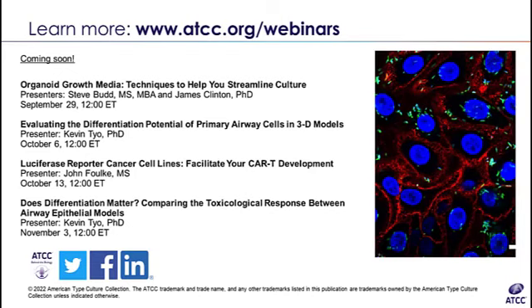If you really are concerned about cells adhering, there are flasks that are sold that are specifically designed for low attachment. So it's definitely worth looking into if you are concerned about that. But in general, it should not have any sort of issues when using a suspension cell line with cell culture treated flasks. All right. I like it.